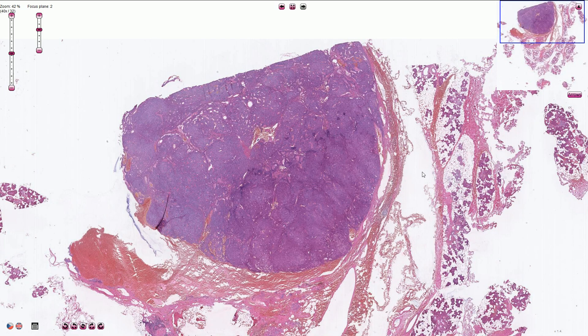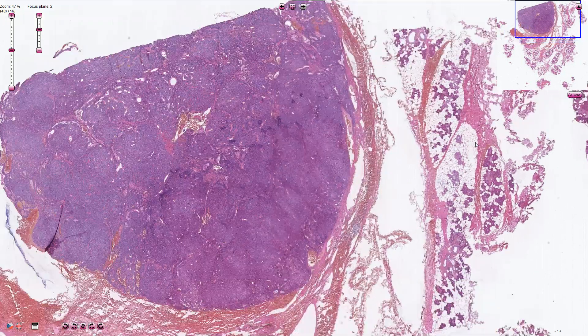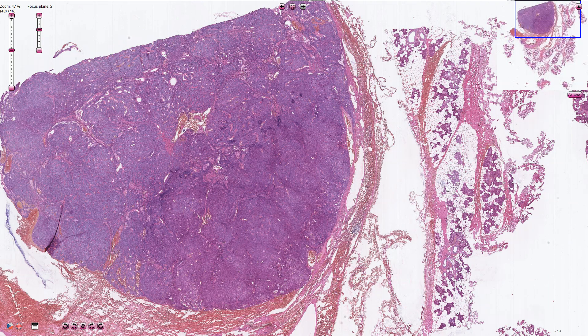In this part of the picture we see salivary gland parenchyma, which is composed of multiple nests of serous salivary gland tissue with a lot of adipose tissue in between the nests.